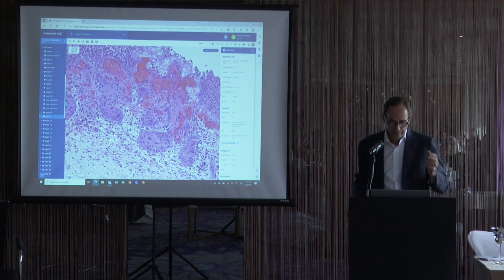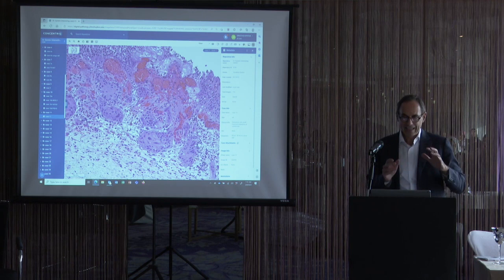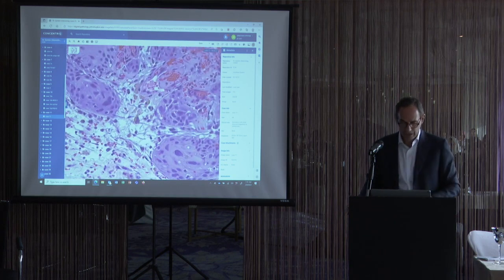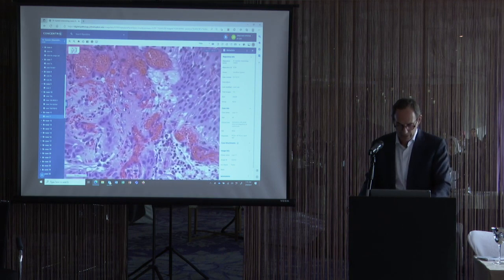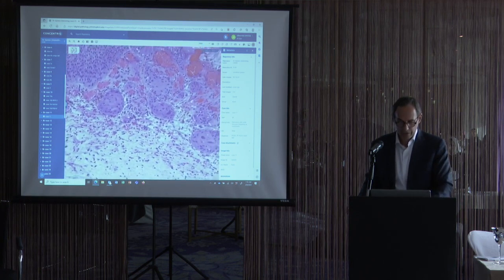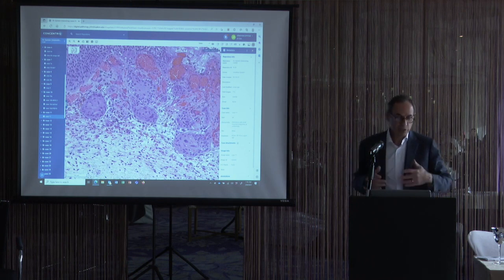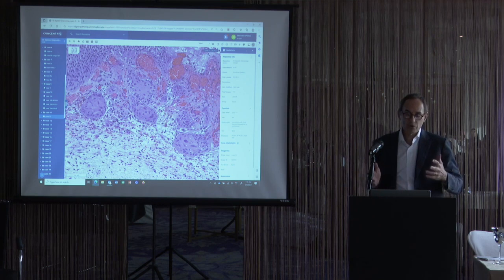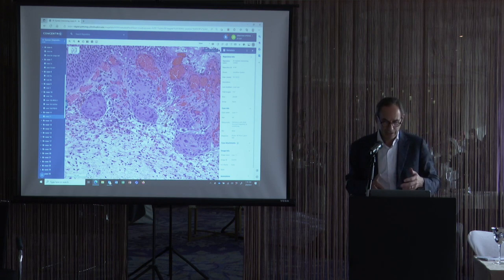no problem. But with bladder, as I'll emphasize tomorrow, this is just a prelude, it's critical to look at the background stroma, look at the whole lesion, don't just focus on the epithelium. When you look at what's intervening between those nests, we see a lot of hemosiderin, we see a lot of red blood, and we see this pink acellular material, which is fibrin. That's not the background that we see with invasive urothelial cancer. Invasive urothelial cancer, most of the time you have no stromal reaction. At most, maybe sometimes a little cellular stromal reaction, but never hemosiderin, never fibrin, and never hemorrhage.